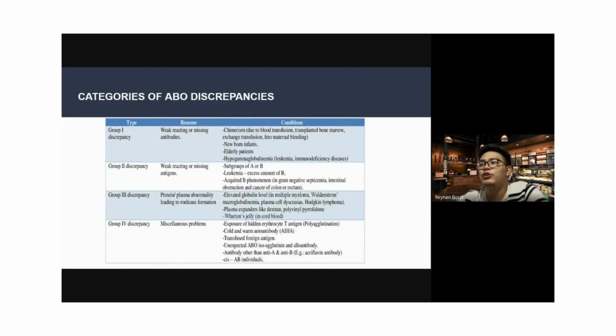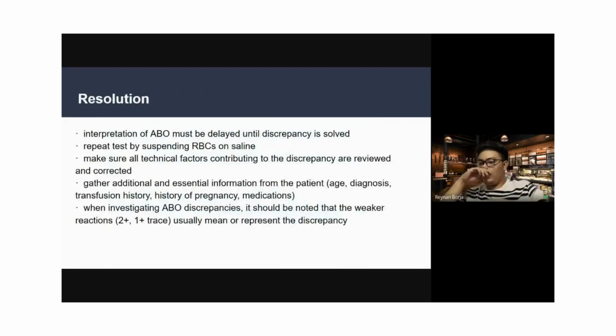Okay. Siguro basahin nyo lang to. And sa libro, marami ditong about dyan sa ABO discrepancies natin. Okay. Before tayo dito tuloy, ano yung mga some causes kaya nagkakaroon ng false positive? False positive, ibig sabihin ng false agglutination sa gel card or sa tube method. Meron tayong Rouleau formation. Di ba pag yung RBC natin is nag-Rouleau, nagmumukha na siya agglutinated.